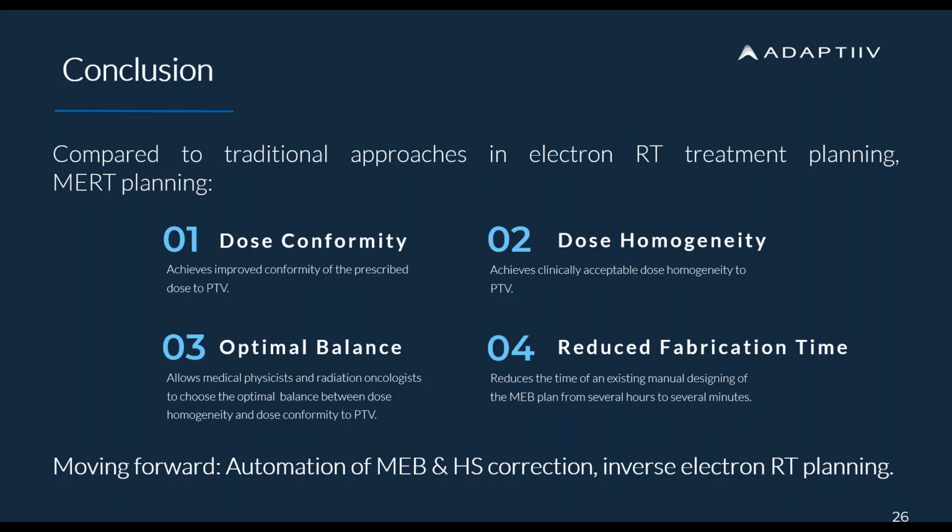You would need to put what is the RED of your filament in order to perform the calculation. So as I said, many filaments, but PLA and Cheetah are the ones we actually offer and the ones we validated. Yeah, and Cheetah being TPU, thermoplastic polyurethane.